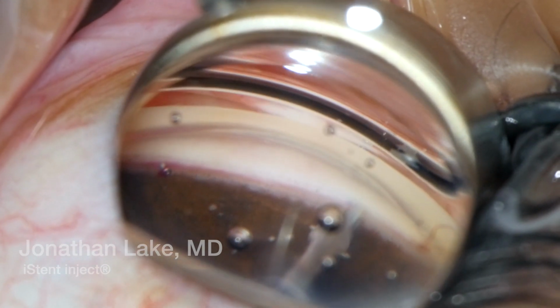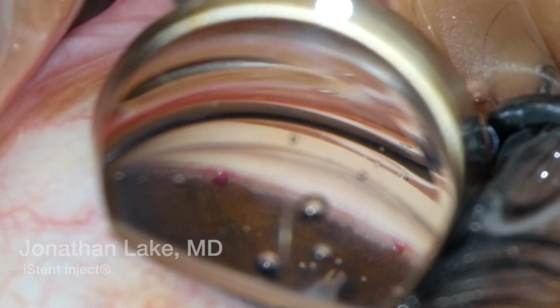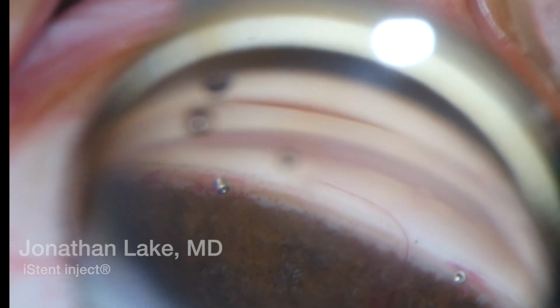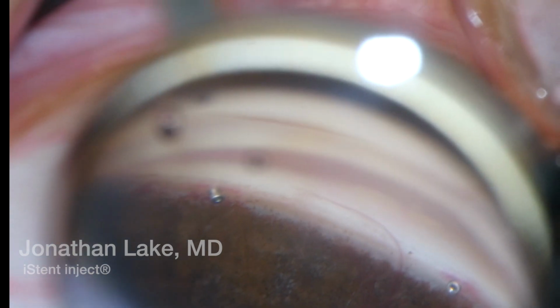But here we indent, we'll see the V. So I apply a little bit more pressure, not over pressure, and then we'll see a nice implantation right here on the right. And here we confirm that the left stent was under implanted.